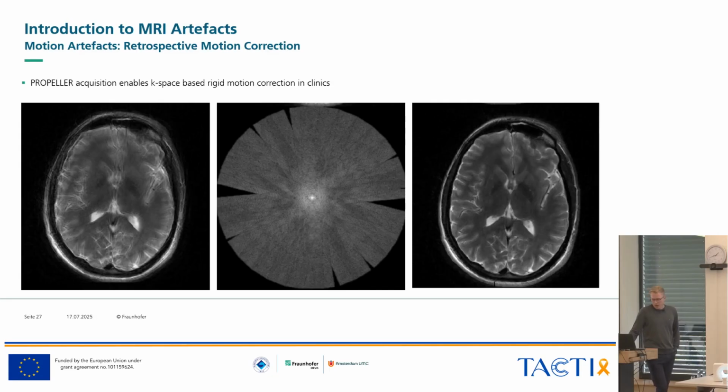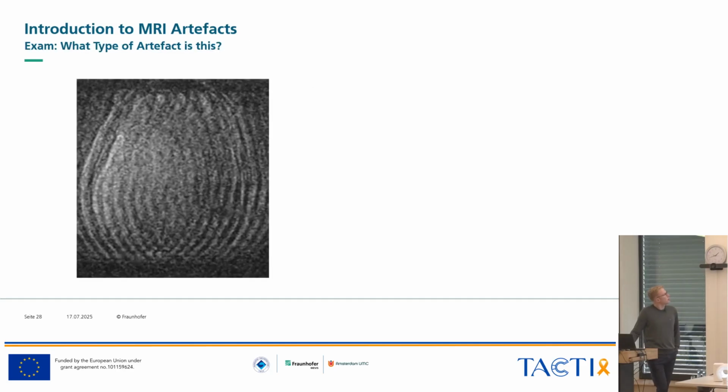So the last artifact that I want to show is this one. This is the final question to succeed in this exam. If anyone can tell me what happened there, that would be really cool. Yeah, it's related to motion.